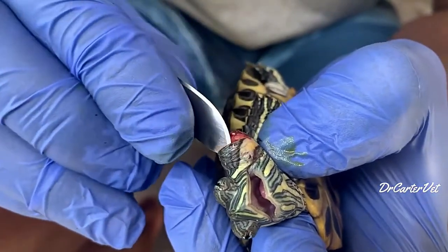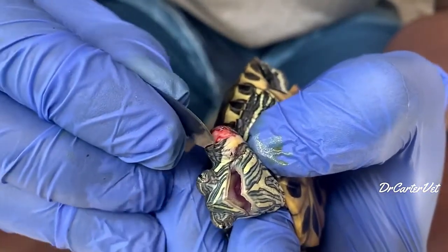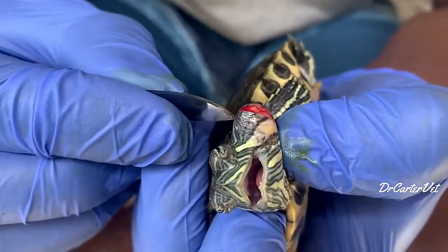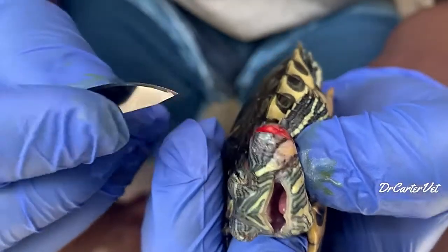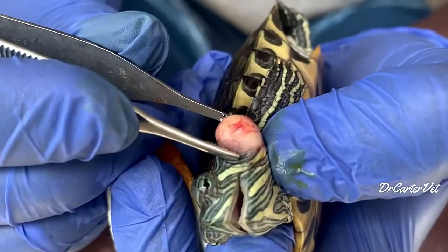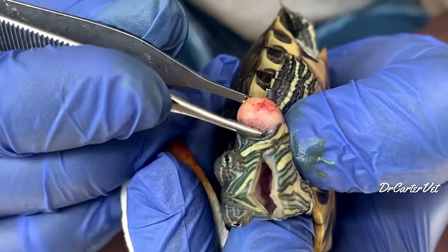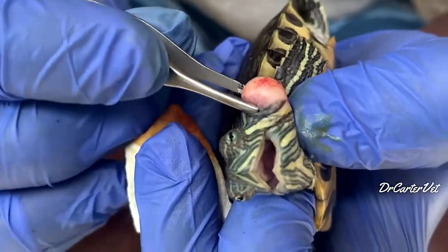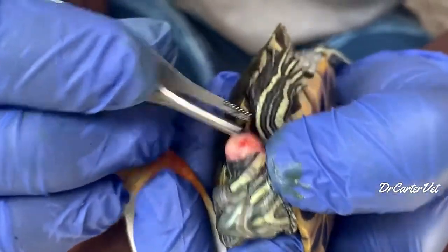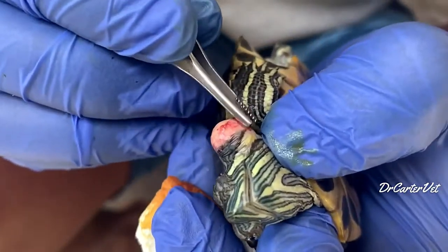Next, the skin over the cyst will be very thin, as you can see here. So just using a blade, you sterilize the area and use the blade to open the skin. Then you have to maneuver the cyst. Now, although it's an abscess, it forms a really strong cyst.